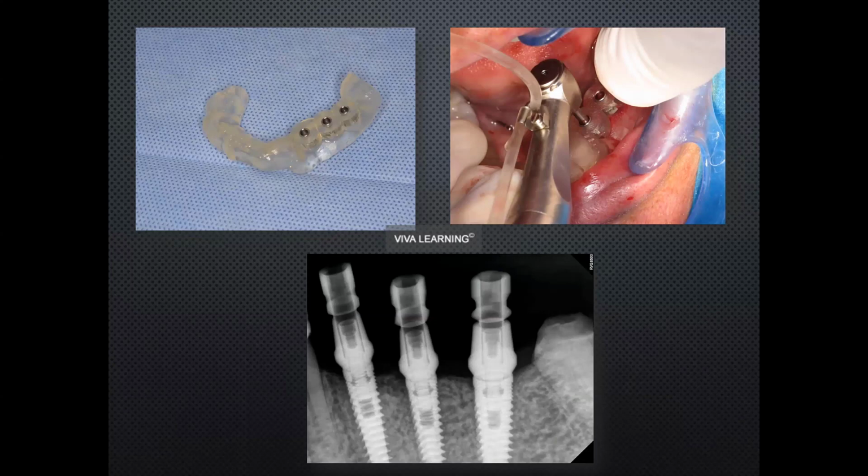But instead of me worrying about my spacing for 3 implants, instead of a 3-unit bridge, to give the patient a little more cleansability and flossing, with this guide, I was able to get the actual preliminary drills in the right place, right time, and then from there freehand these into place.